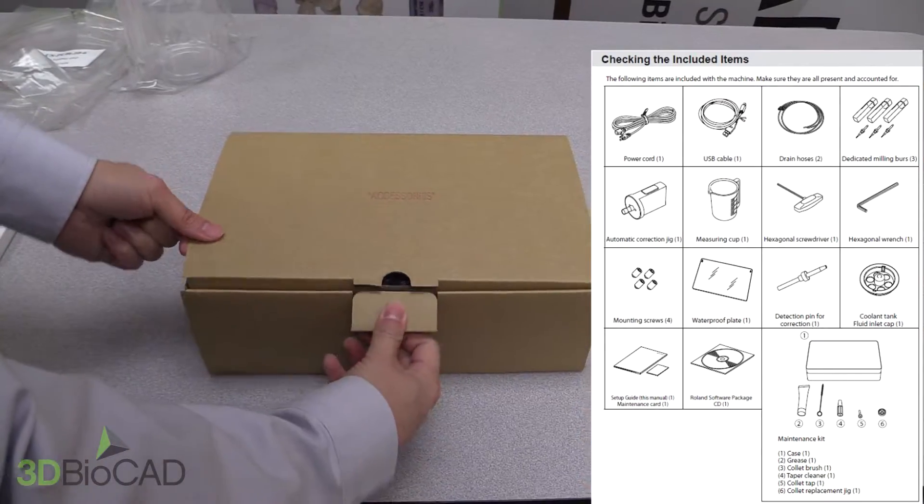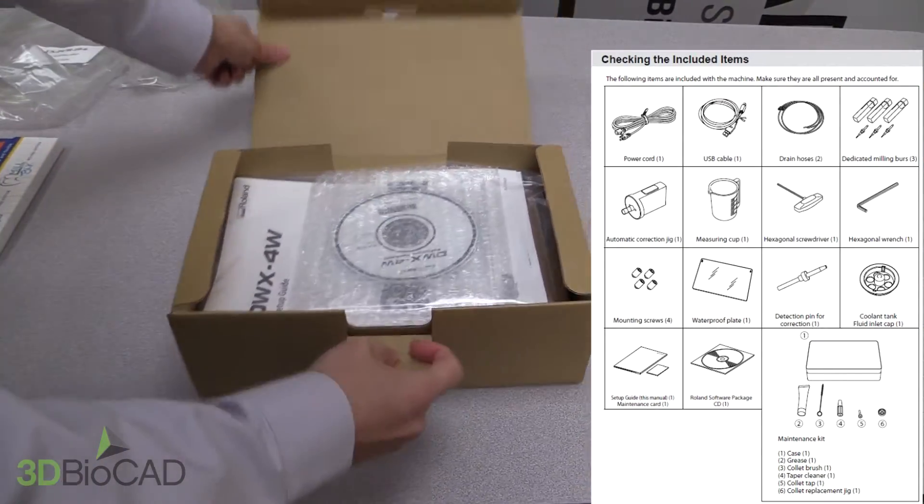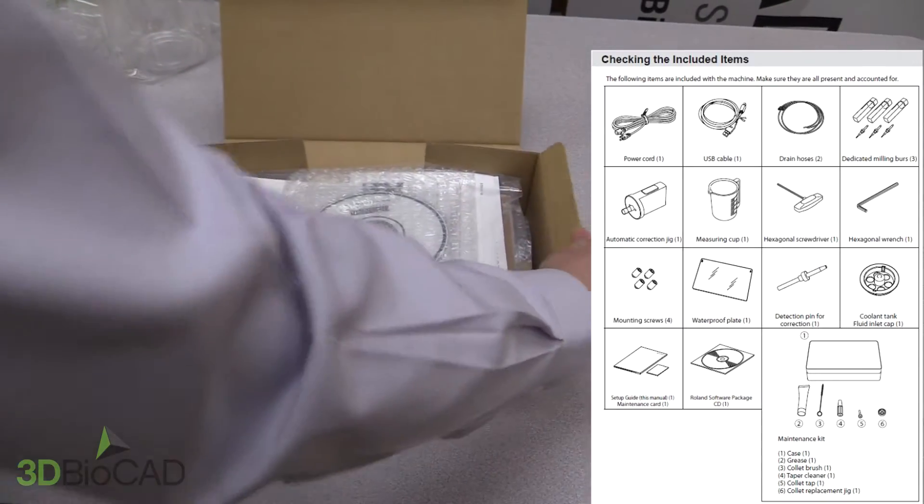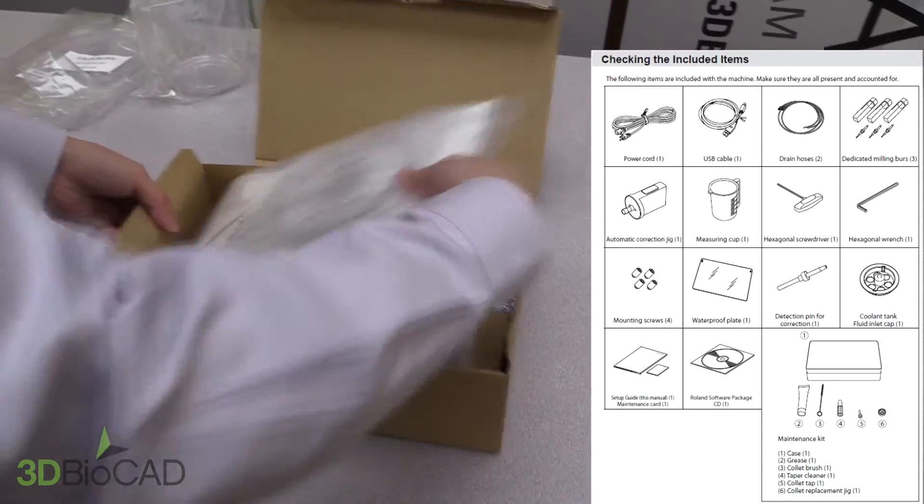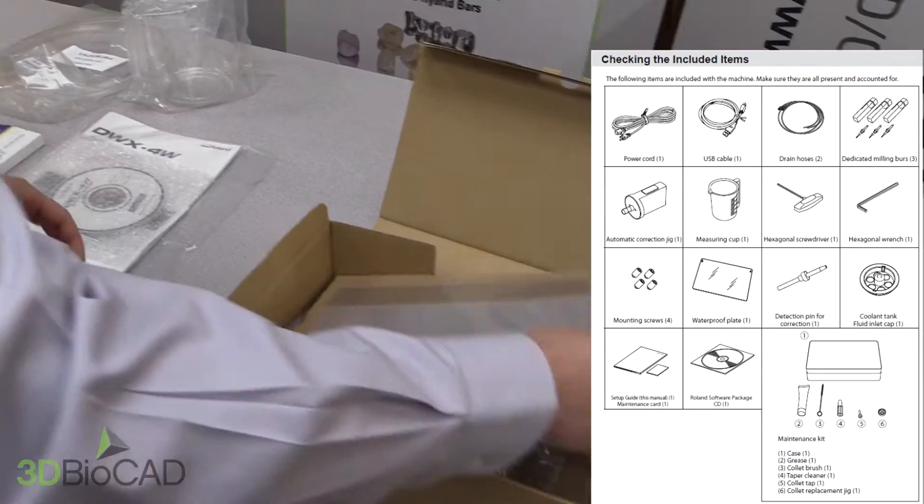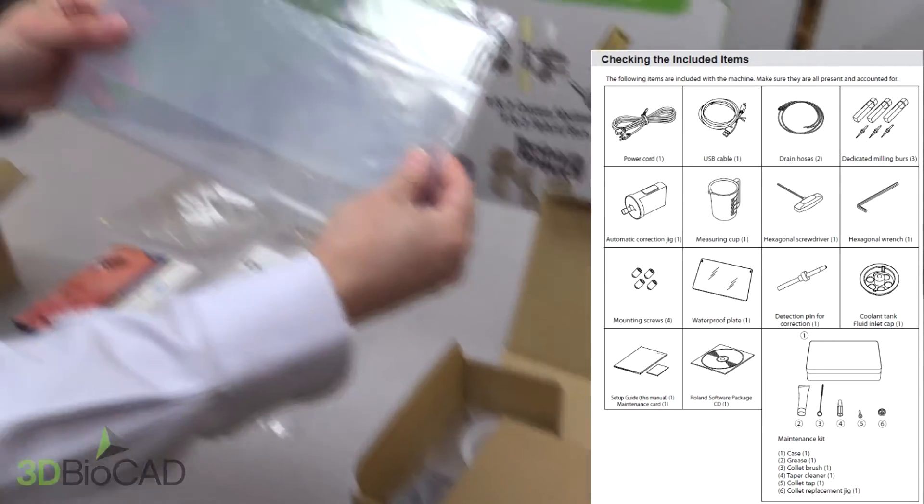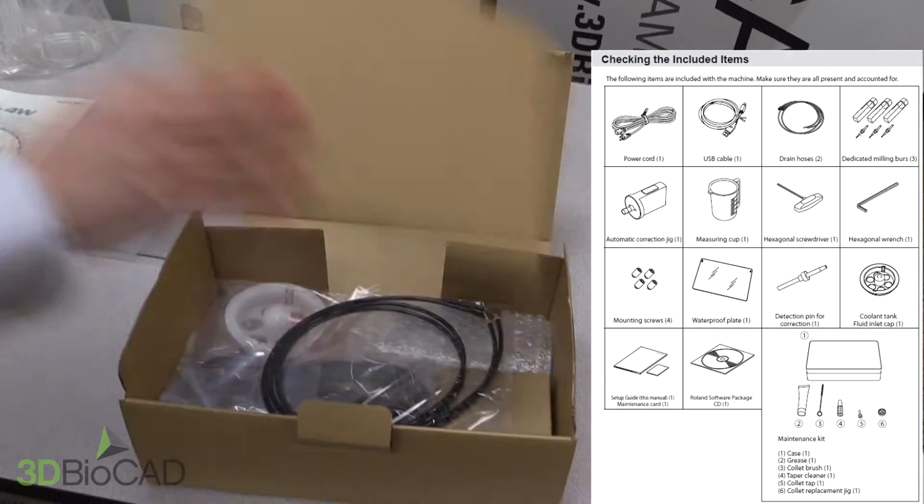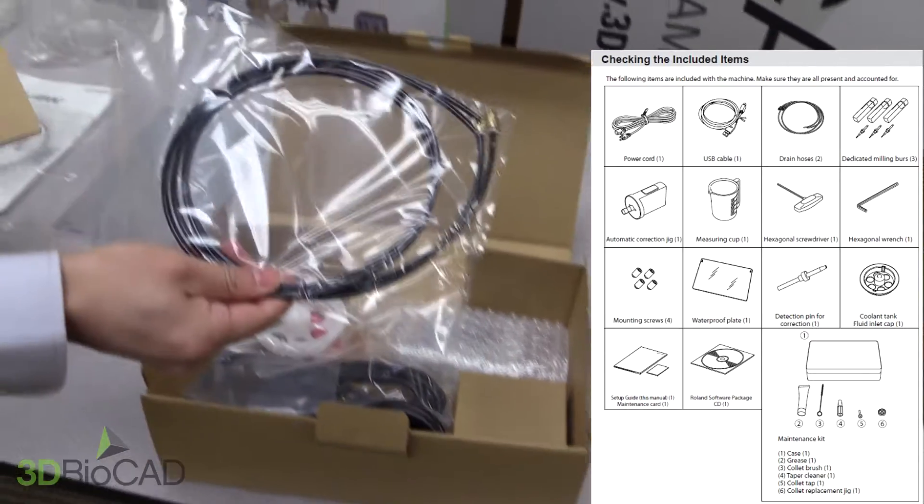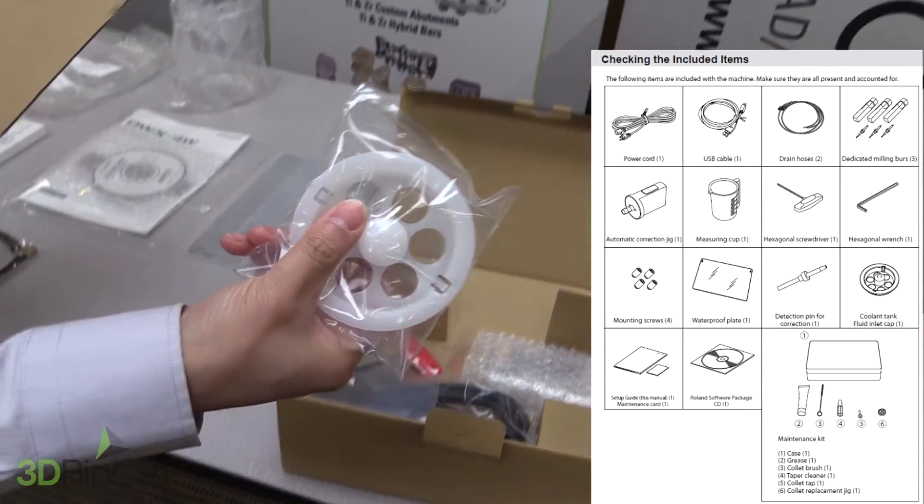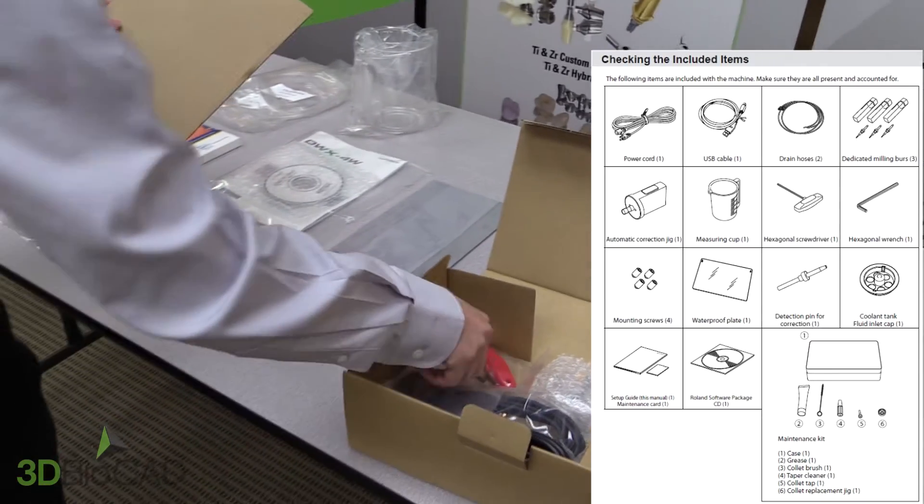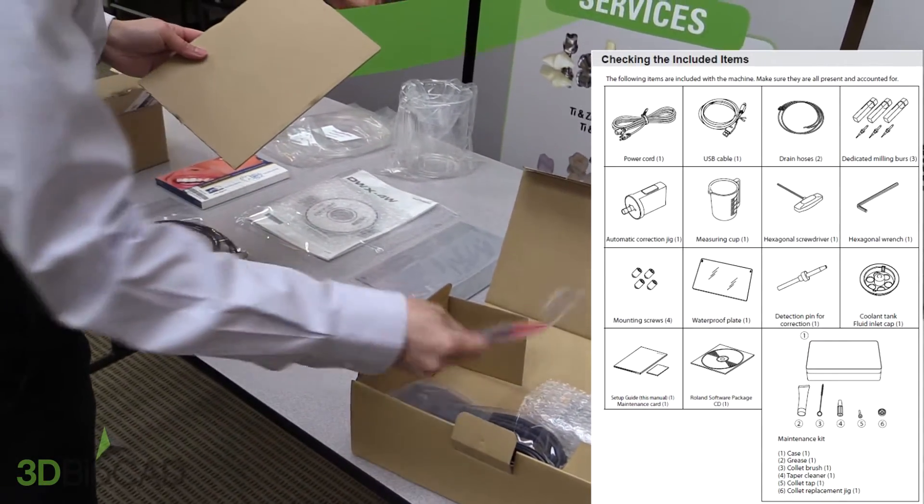Inside the accessories box, you should have the following. You will have the setup guide and maintenance card. You'll see a waterproof plate, drain hoses, a coolant tank cap, one hexagonal screwdriver and one hexagonal wrench.